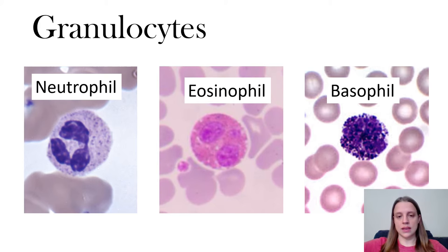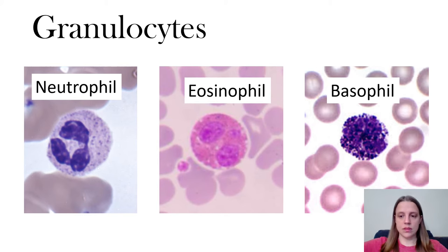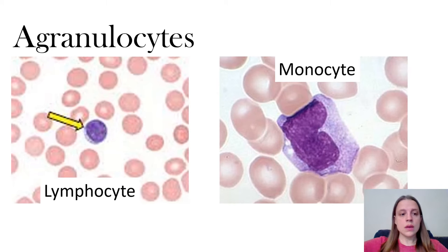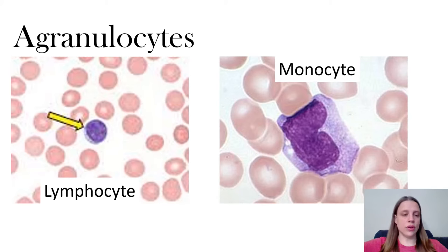In the eosinophil you're seeing two evenly round nuclei, and sometimes you can see that the two round nuclei are connected by a little strand in between them, so it looks like an old telephone — that's how you can tell it's an eosinophil. For the basophil, you can tell because you can't even see a nucleus; it's so dark.